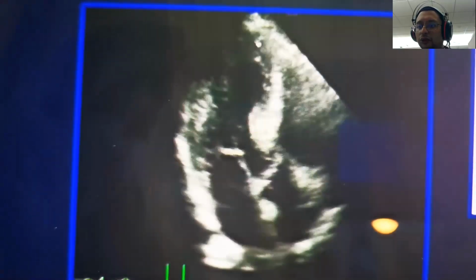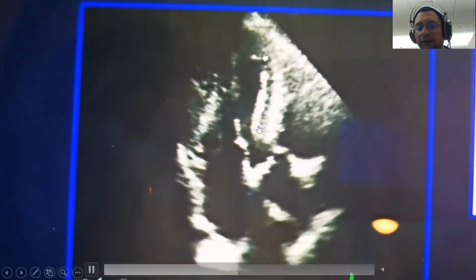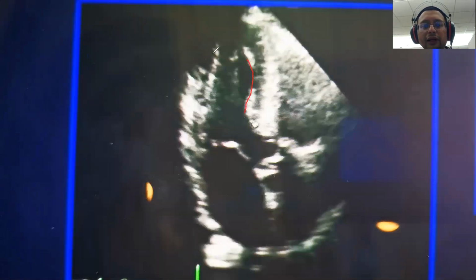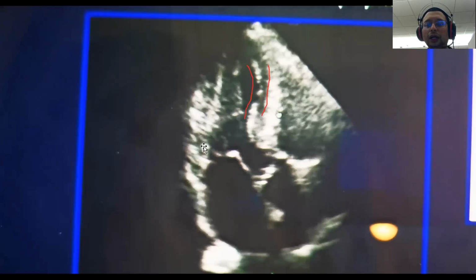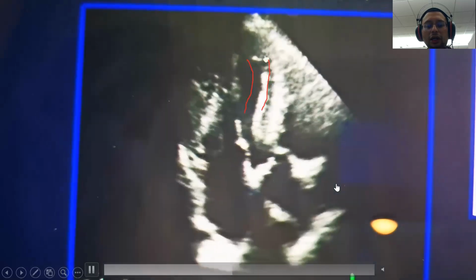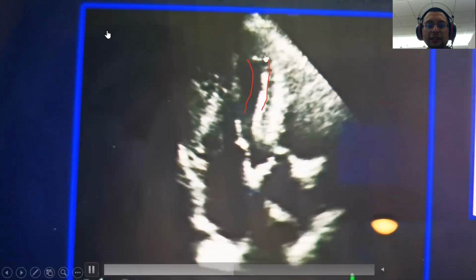This is not sensitive or specific, but if you just wanted to know what happened, it seems like the left ventricle has two layers. So you have one layer here in the endocardium. So you have one bright spot there and you have another bright spot there. Okay. So this is the binary appearance. It's by no means specific or sensitive. I just wanted to tell you what I mean by binary appearance. Okay. So Precious, when you don't have alpha-galactosidase enzyme or have very little alpha-galactosidase enzyme level, what happens?